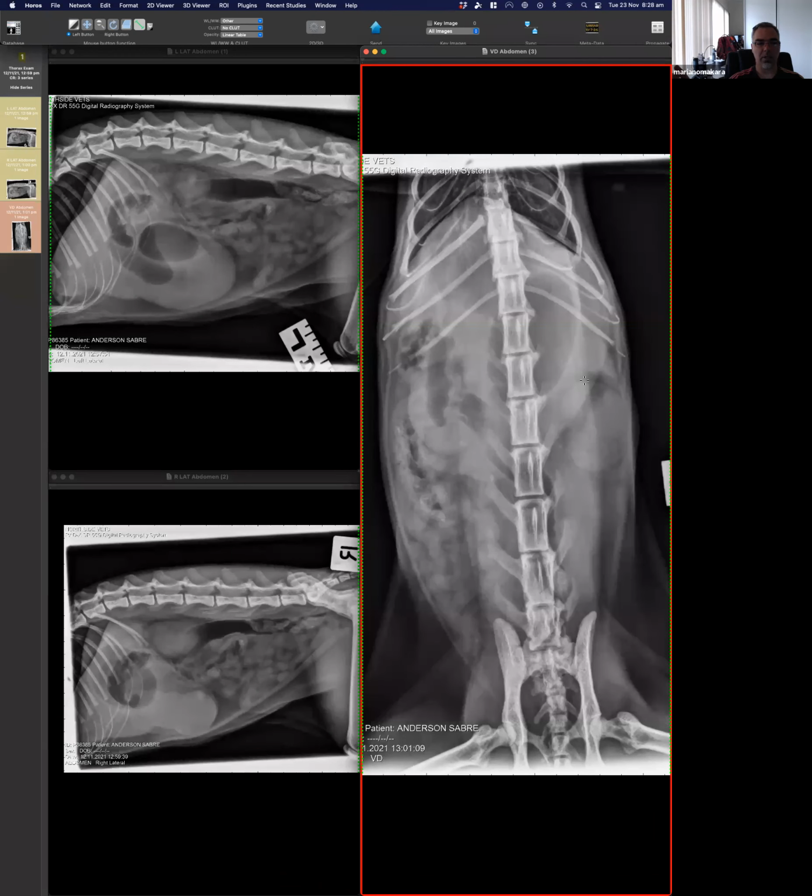So I take that from your answer that you think he's obstructed. Yeah, there's obstruction, because we can't say it's foreign body, and there is dilation. Well, there is excess gas in the duodenum, so I don't think it's at the pyloric outflow. I think it could be also involving the duodenum. Maybe something tethered in the pyloric outflow potentially.